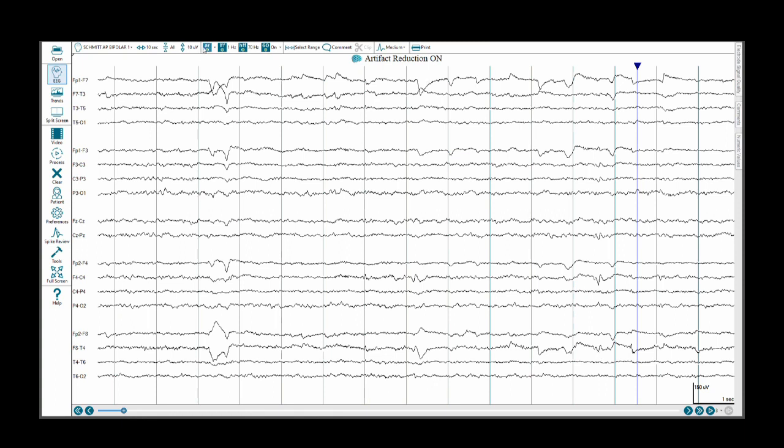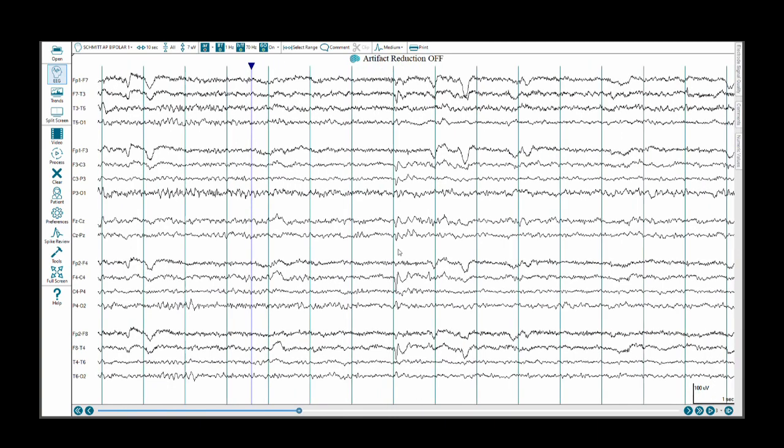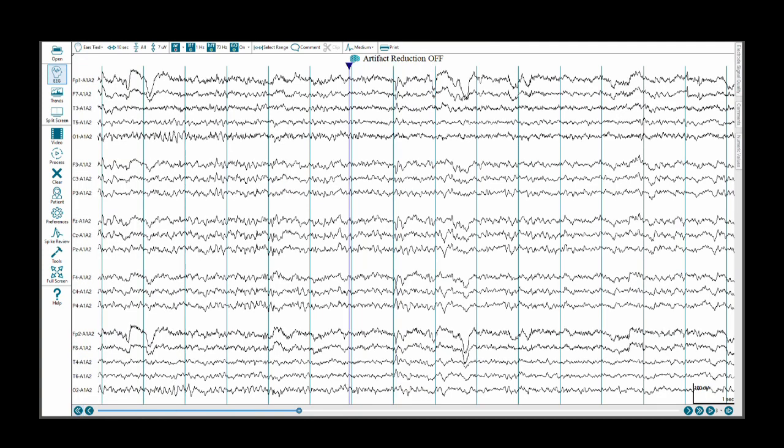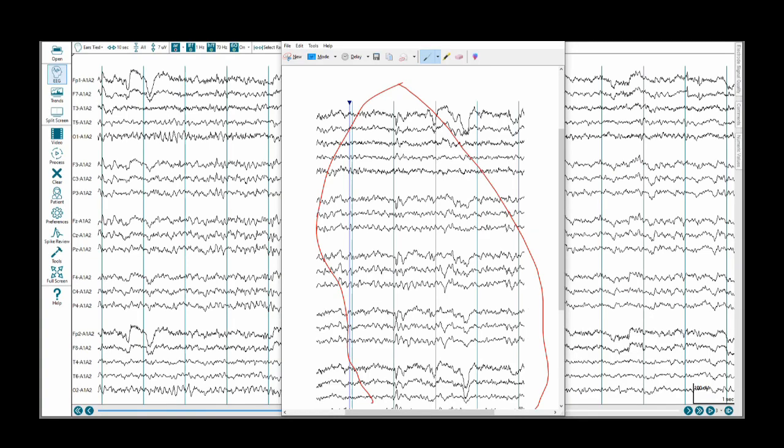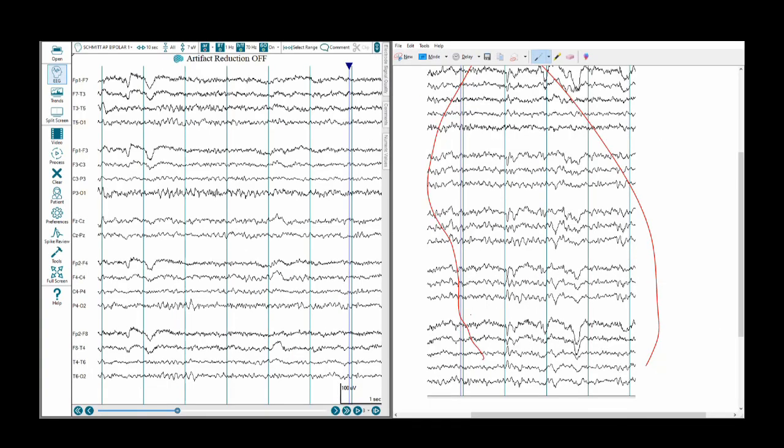We will go back to default sensitivity, and perhaps making sense of the left hemispheric polarity distribution will be more of a challenge. So we went back to the double banana just for a moment to pick out a nice phenotypically robust example of this discharge. We are going to work through the logic of why we see these particular deflections here. But before we do that, we will switch to an ears-tied referential montage. This particular discharge is most readily seen in T6, T4, P4, C4.